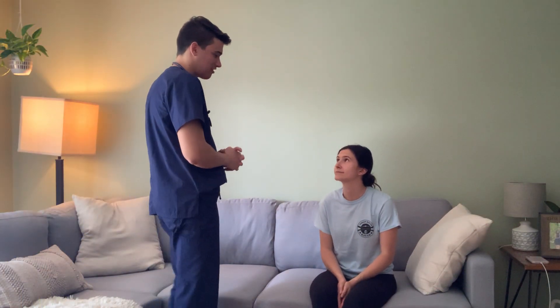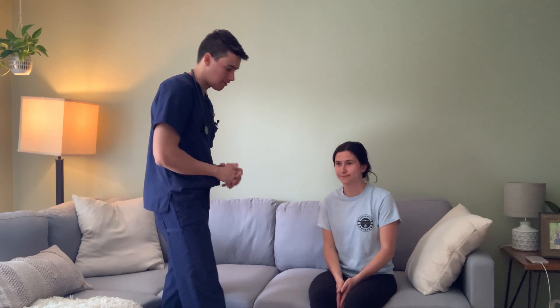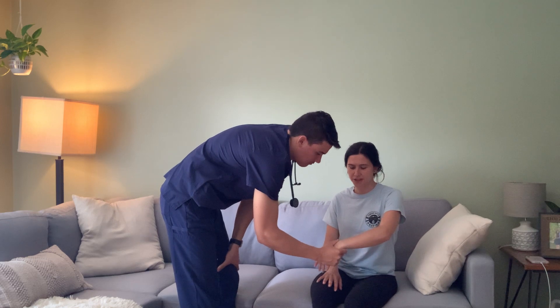Hello, my name is Crystal. I'm one of the student nurses here at UNE. We're going to be doing a bedside health assessment. Is that okay with you? Yes. Can I see your name and date of birth? Kellen Thompson, July 30th, 1997.